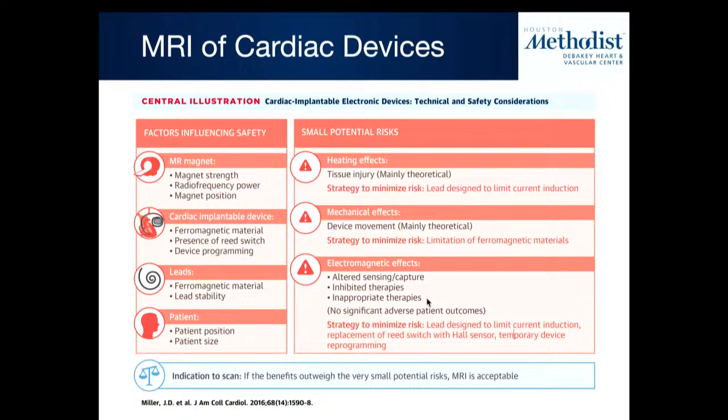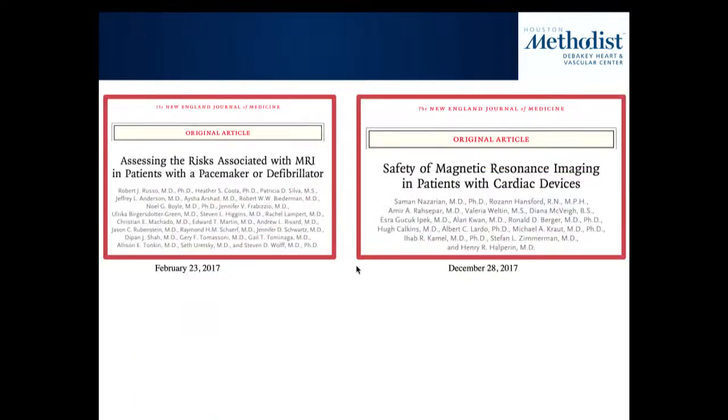are already FDA conditional, that have been tested and FDA labeled. These are 2 studies that came out both in 2017, which looked at large series of patients with the legacy devices. These are devices that were put into patients before MRI conditional devices came along, asking, can these devices be safely scanned? Using a preset programming approach, these 2 studies demonstrated that it may be reasonable to scan even the legacy devices as well.